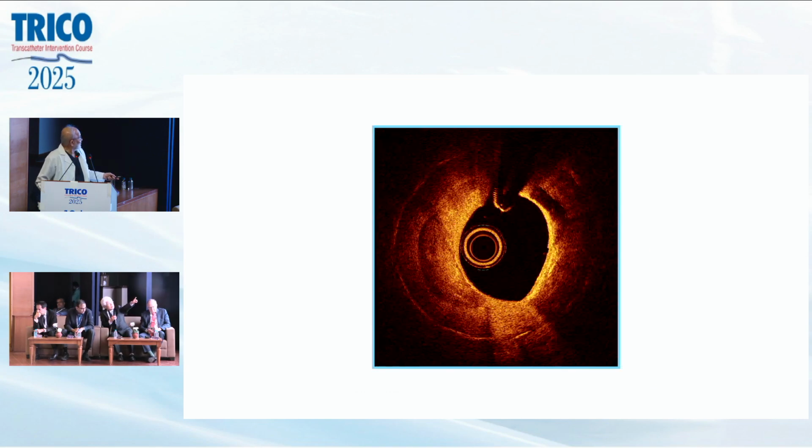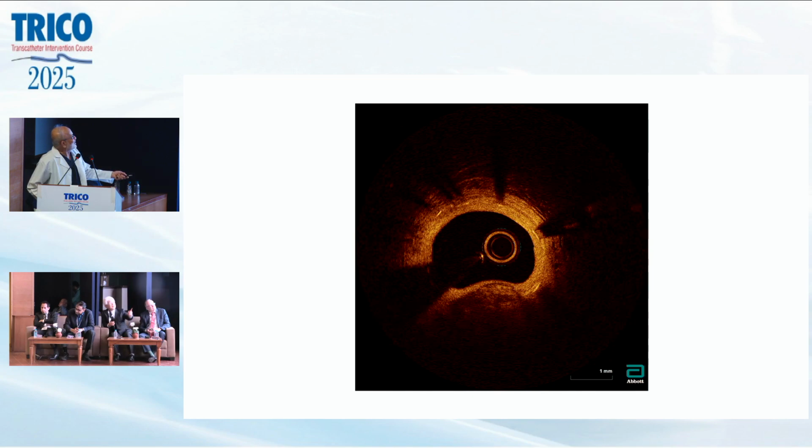And this one. Calcium, right? Pardon? Calcium. This is calcium. So yes, it is very old ISR, right? Yeah, right. Okay. So which category will you put this? F. All right. But the classic F example is this protrusion. This, also the calcium, this is type 6. Yeah, right. But very similar.